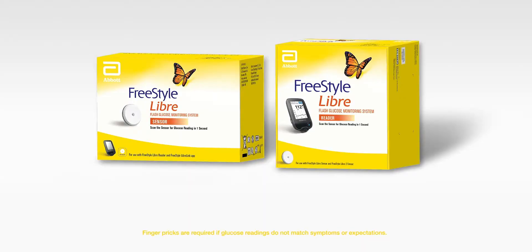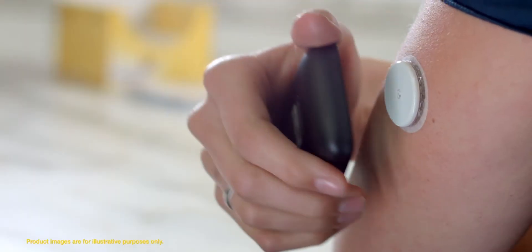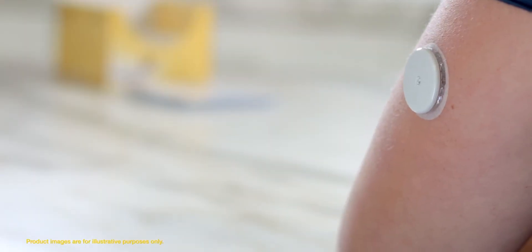But now I use the FreeStyle Libre system. It takes away the pain and worry of checking my glucose. With a quick scan, I can check all the time. I feel I can finally focus on the things that matter most in my life.